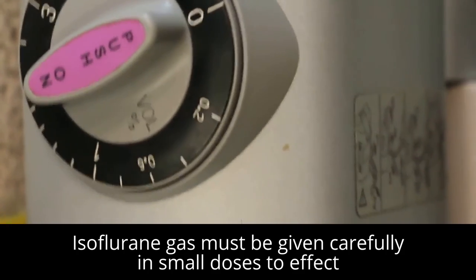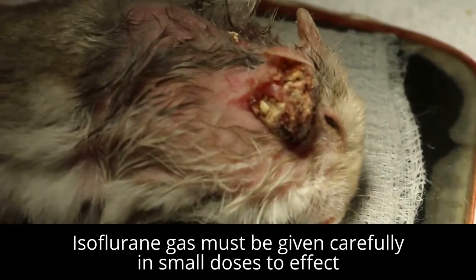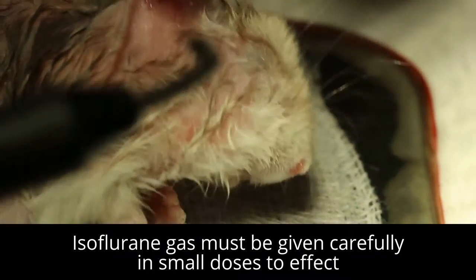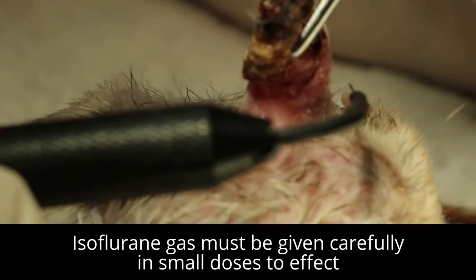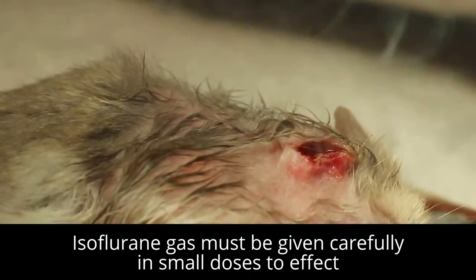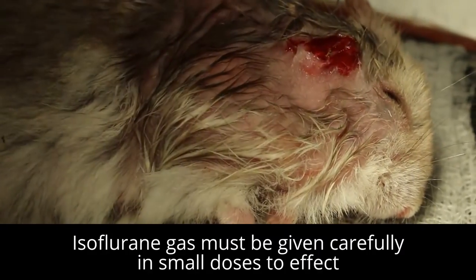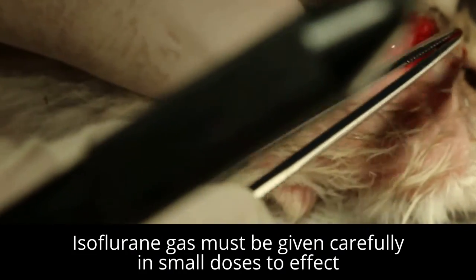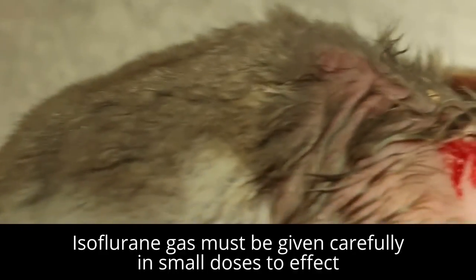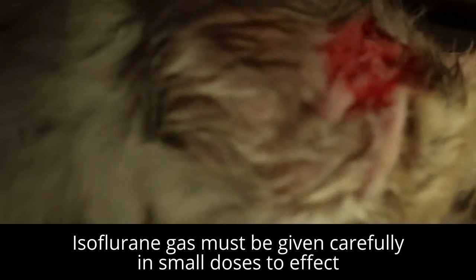Okay, bring it out here. And position it properly. And don't touch your table. Now, as you can see, the whole thing is really a tumor rather than an ear wart. So clean it clear. So let's see whether there's any more left or not. We use the gauze to swab it. Just swab with the blood there.